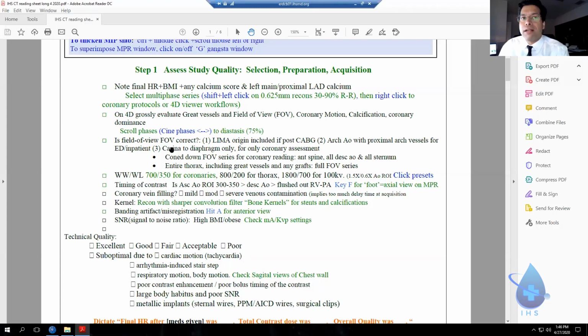And then everybody else, which is the majority of people, 85% of patients in a cardiac CT lab, are going to get just the heart. And that's scanned from the carina to the diaphragm. Most adult hearts are 120 millimeters from top to bottom. And so that's all you need, because you don't need the arch in an outpatient routinely. So those are the three fields of view.